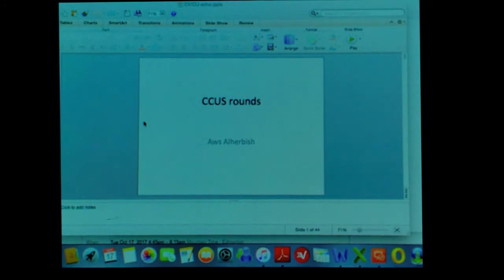They've had one Avalon cannula that's functionally IVC. Oh yeah, really? Wow. Okay. Less recirculation than the two cannulas, though. Yes, definitely, but very position dependent. That's a problem. And physioing the patient and moving the patient is a problem, yeah. Like this guy with our burn, I don't know how they're going to physio him.